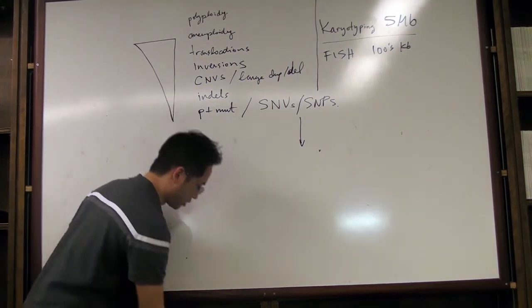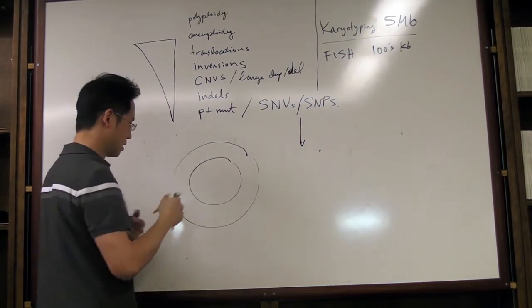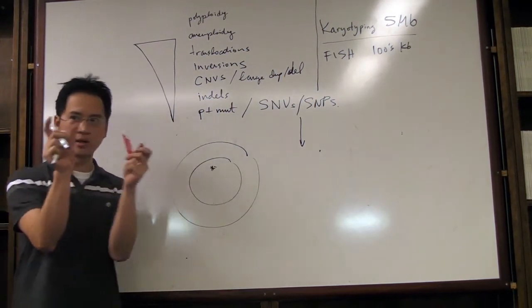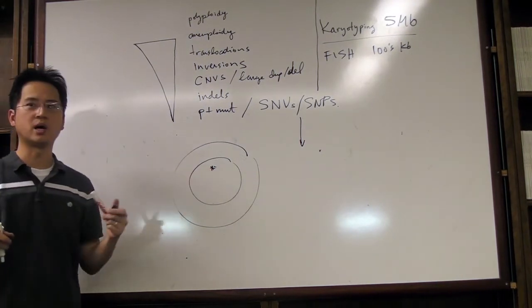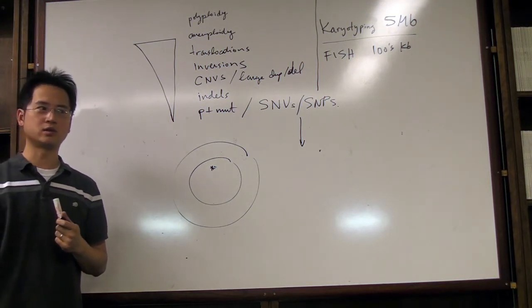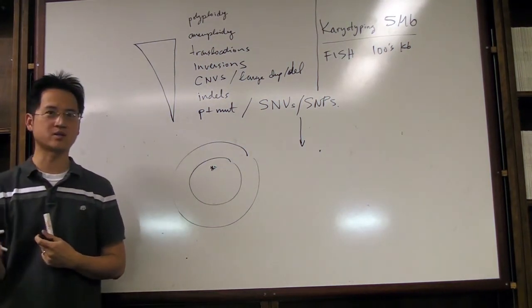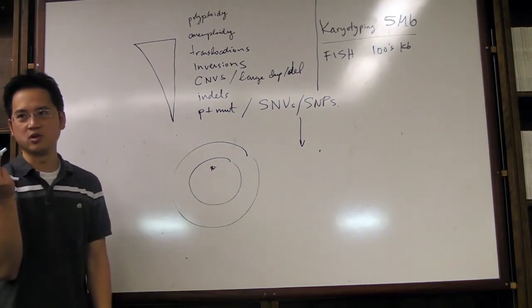Yes, you might get some off-target stuff, but the whole idea is this: you have your cell, your nucleus. Let's just say this is my target. You technically can't see it, right? I have one probe binding to it. So just one snippet of 100 base pair, maybe 5 U's are labeled. Can you see that by light microscopy? 5 U's? No. 5 molecules of FITC, you probably wouldn't. There's a way probably that you can with a very high resolution microscope, but that's a very expensive system, hundreds of thousands of dollars. But yeah, 5 probes, you're not going to be able to see it.